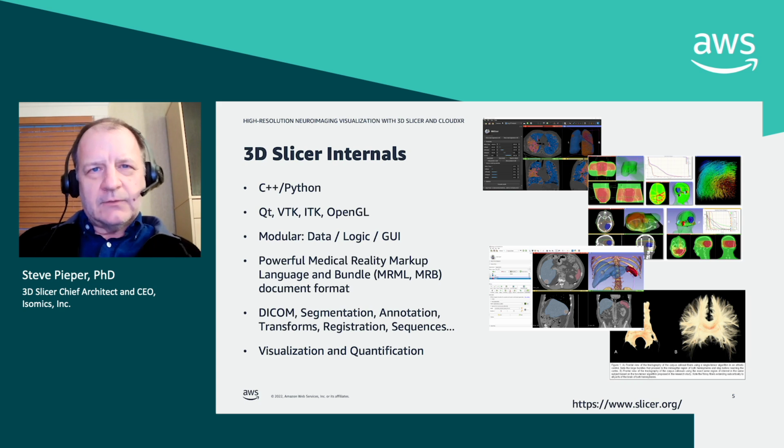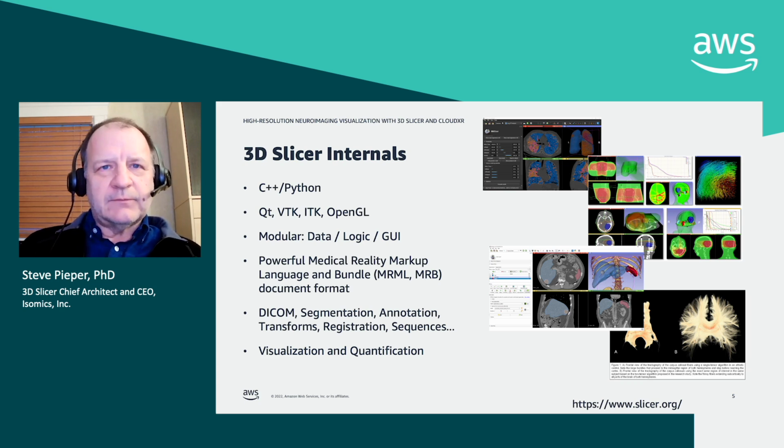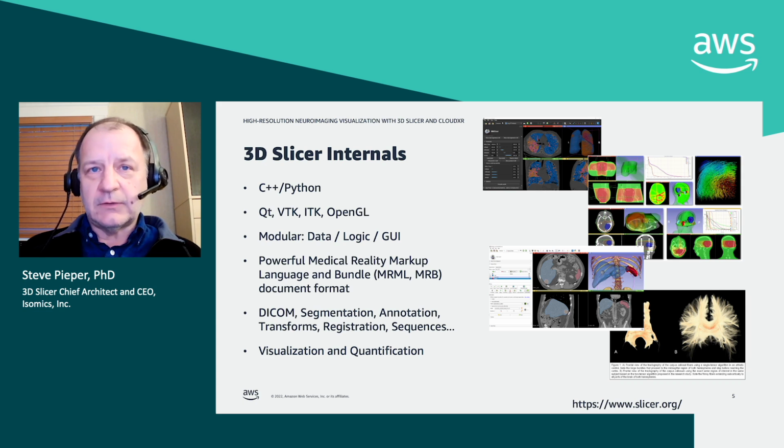And basically, internally, it is a C++ application with an embedded Python interpreter, and you can extend it in either one of those languages. It's written with the Qt user interface environment, with the visualization toolkit VTK, makes extensive use of ITK, the Insight toolkit, and of course, it's all built on standard computing platforms and graphics libraries such as OpenGL. It's a very modular platform.